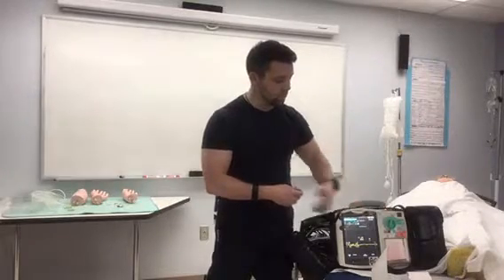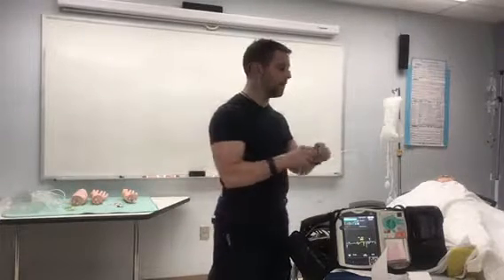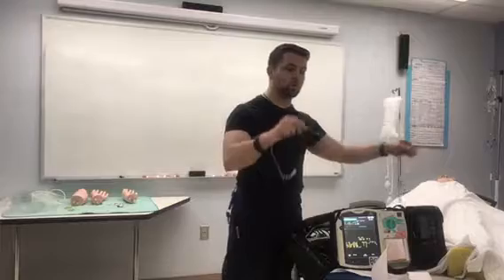And then that's pretty much it. We're monitoring our system. If we notice that the amplitude of our line keeps going down, down, down, that means that we're losing pressure somewhere. So we're getting too much damping. And we're going to go back. We're going to check our connections. We're going to see if we have any air in the line that's kind of snuck in there. Maybe we took the bag off.